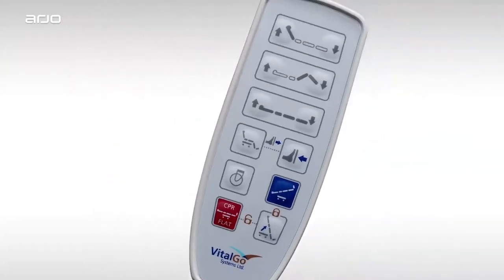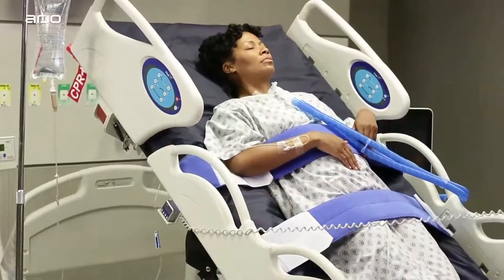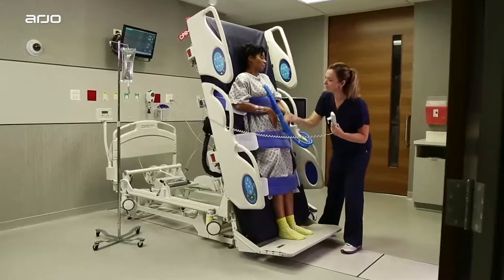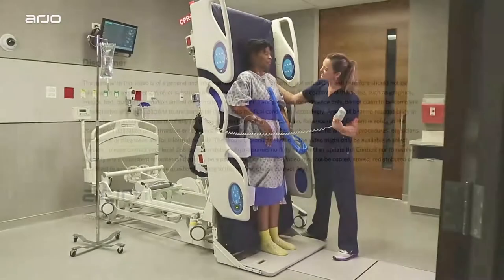Those are the controls of the wired hand pendant, a handy and convenient feature of the Total Lift Bed. We hope you found this demonstration helpful and that you now see how easy and intuitive it is to use all the Total Lift Bed controls and functions. For complete instructions, please refer to the Total Lift Bed instruction manual.